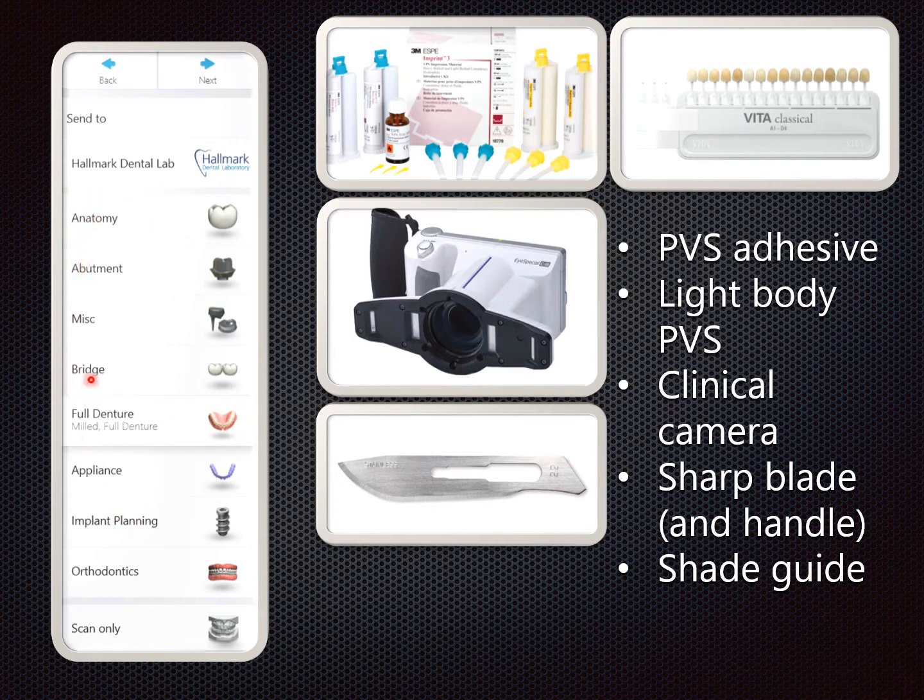What we see here is the order form, which is essentially the prescription for choosing a full denture application. Your tray setup or room setup for this procedure would involve a tray adhesive, polyvinyl light body material, a clinical camera, sharp blade and handle, and a shade guide.